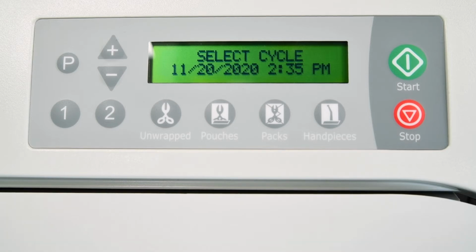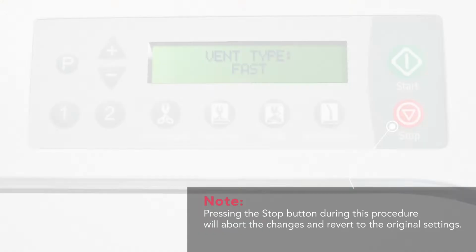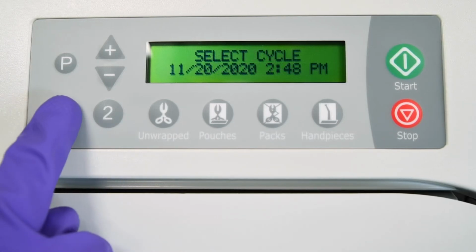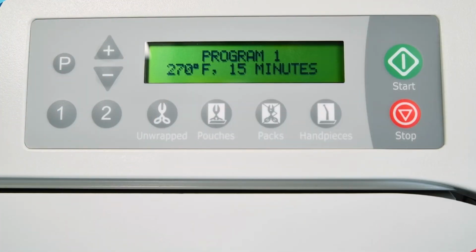To create a programmable cycle, press either the 1 or 2 button on the control panel. Then follow the prompts on the unit display to set the desired sterilizing temperature, sterilizing time, type of vent, and amount of drying time. For this example, we'll use Program Button 1. The display will show the currently stored program and all cycle parameters to reprogram. Start the process to create a custom program by pressing P.